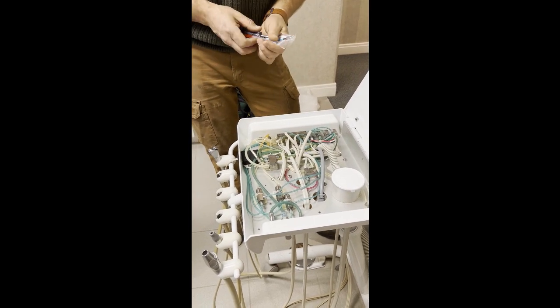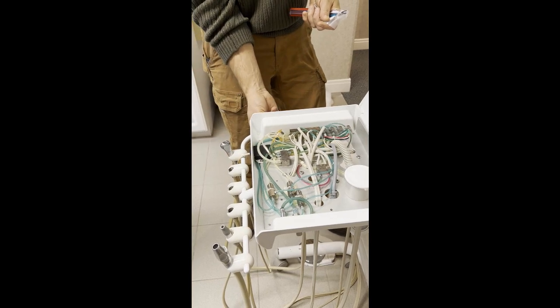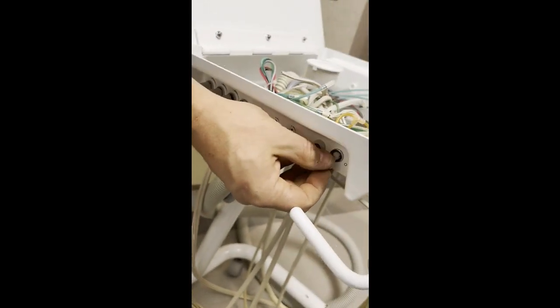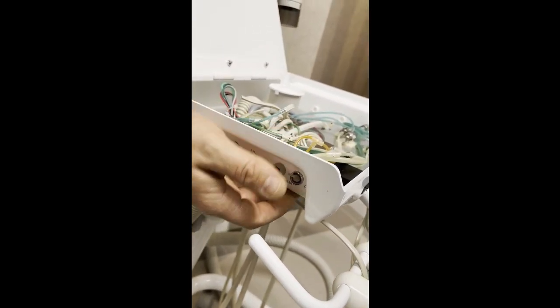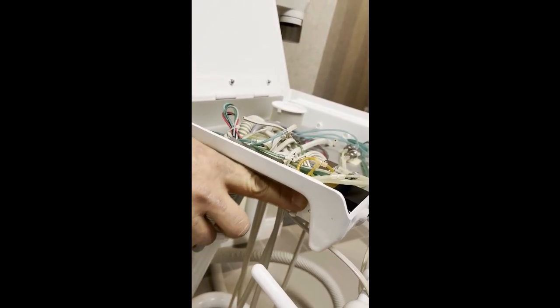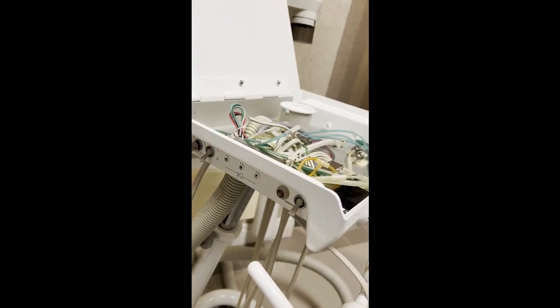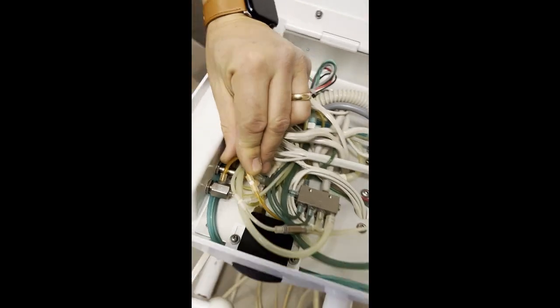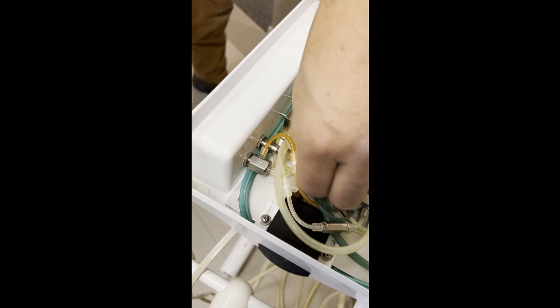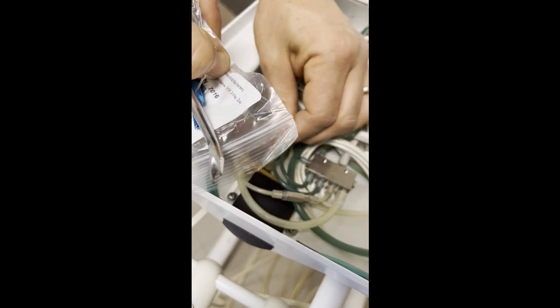Today we're going to go ahead and cover how to replace a leaky master valve. The master valve is the valve that when you turn the system on and off, it energizes the system. Now, the master valve, when it's turned off, if it has air leaking out of here, then that shows that the valve is bad. This valve always has air pressure going to it on the side, and so when we kink the line, that causes the air to stop.